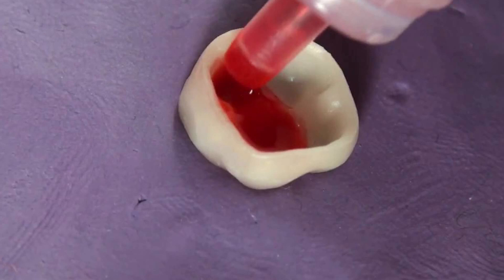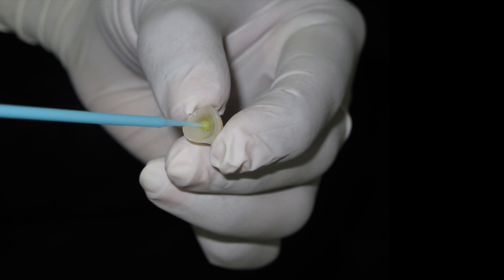We are all aware about the bonding protocols for lithium disilicate restorations. It involves the use of hydrofluoric acid and silane coupling agents to make the inner surface of the restoration more receptive to the bonding procedure. Zirconia, on the other hand, is slightly different.